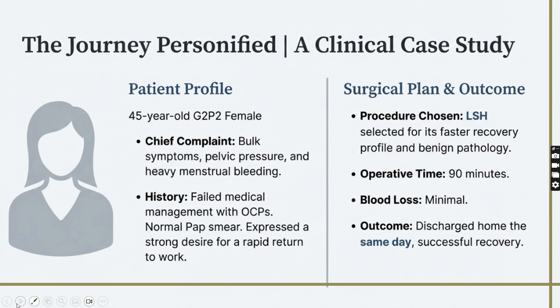In this case study, laparoscopic subtotal hysterectomy was chosen for a 45-year-old female with benign bulk symptoms who desired a rapid return to work. The surgery was successful and she was discharged home on the same day.